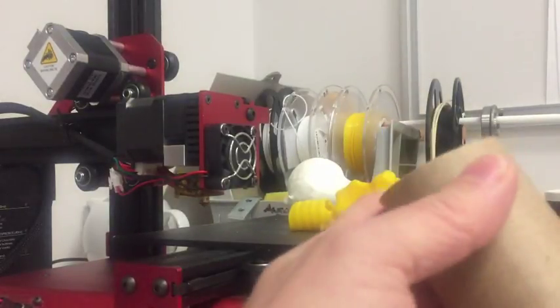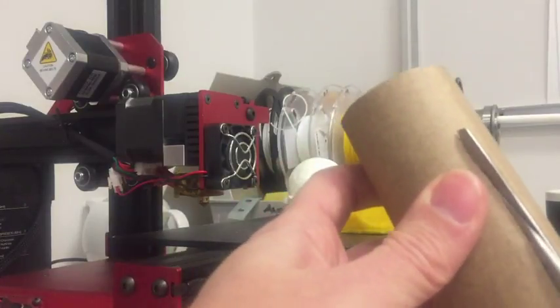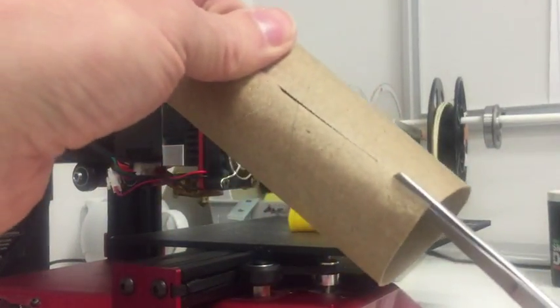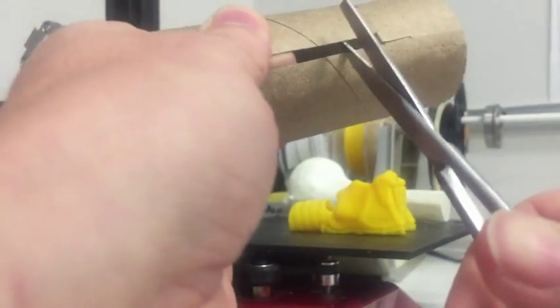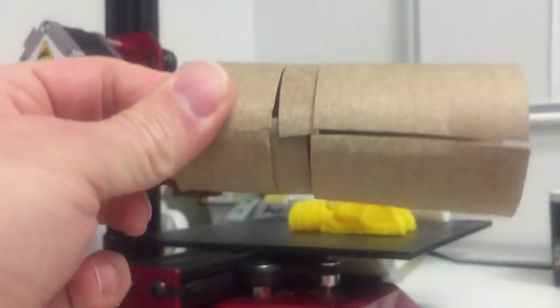I'm not going to map it out here, I'm just going to get cutting. But essentially, we cut all the way at the front to near the top. And then we cut a little bit down again from the top. Right, then we come down a little bit and cut straight out about halfway around, and do the same on the other side. And that is ultimately going to be the cricoid ring.